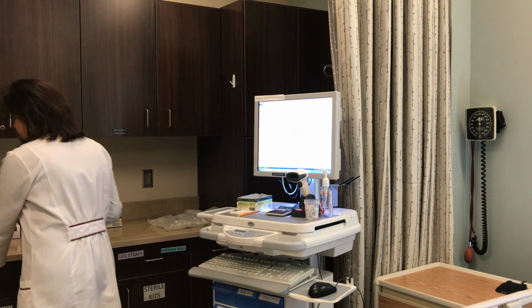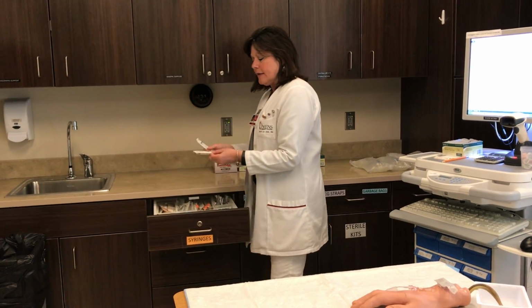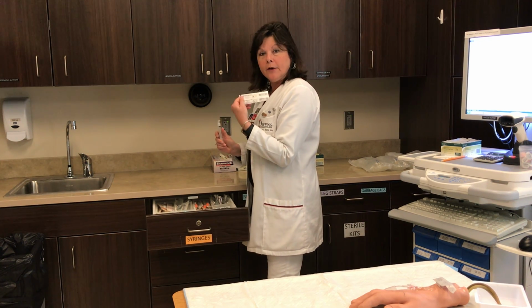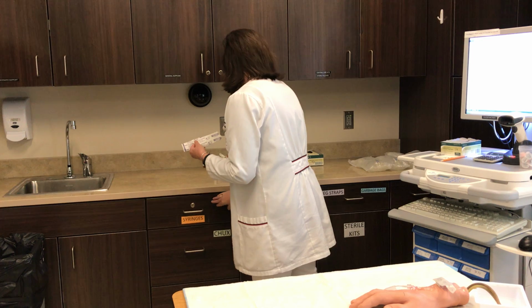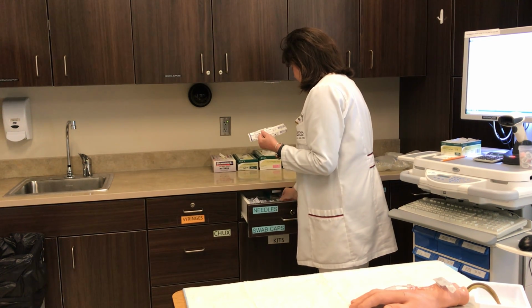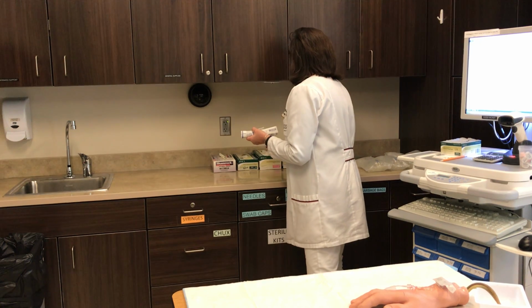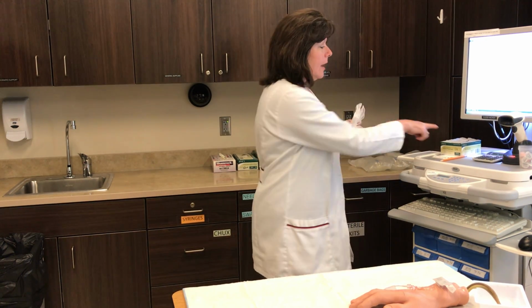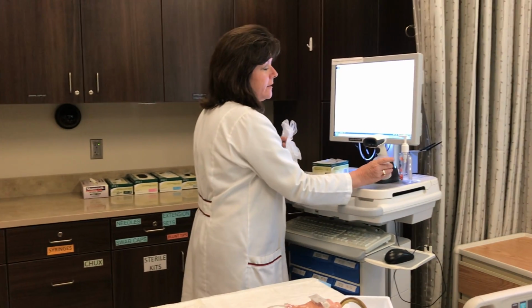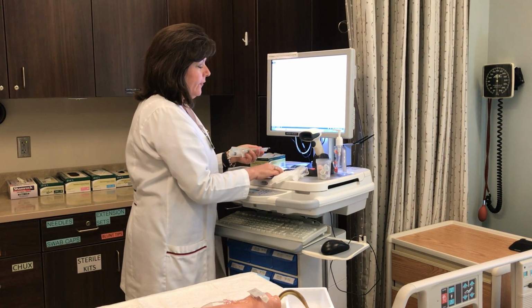Gather necessary equipment and supplies. Your syringes are located in the drawer at the side of the room. And since I haven't done the calculation yet, I'm going to grab a 5 ml and a 3 ml syringe. I'm also gathering blunt tip needles and clean gloves. Alcohol swabs are on my WOW and also swab caps. I have calculator and pencil available for my calculation.